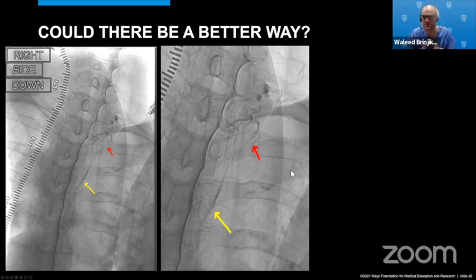During the early days of COVID, when we were shutting down our hospitals and saying you can't do cases, instead of going fishing, I started looking at the myelograms, reading some of the literature, and trying to understand what's going on with these CSF venous fistulas. And I saw this CSF fistula coming from right T2. And I saw how it was going into a very large vein. And I thought to myself, this vein is very large. If we could identify what vein this is, it must be feasible to get into the vein, potentially embolize it, and potentially obliterate the CSF venous fistula.